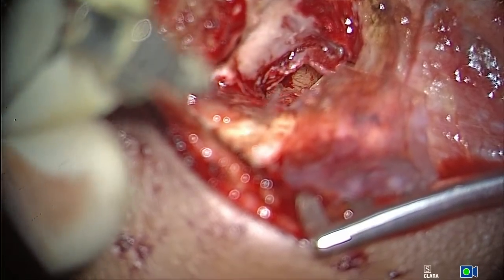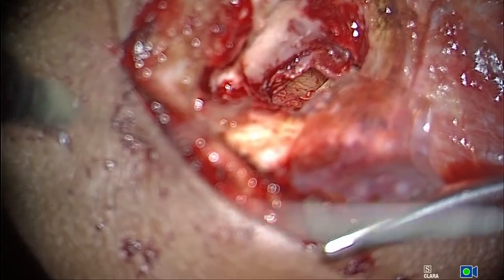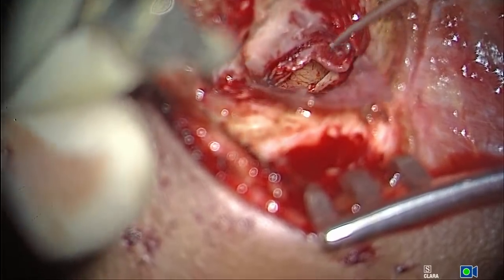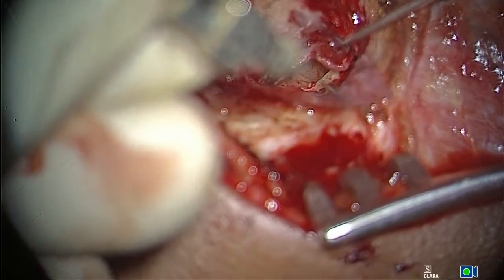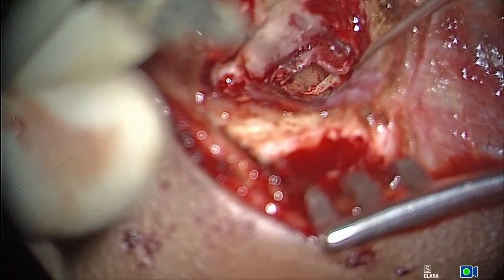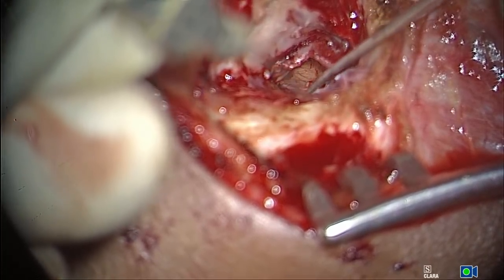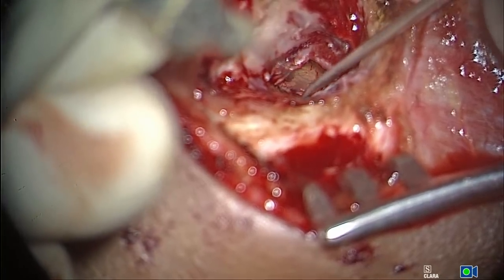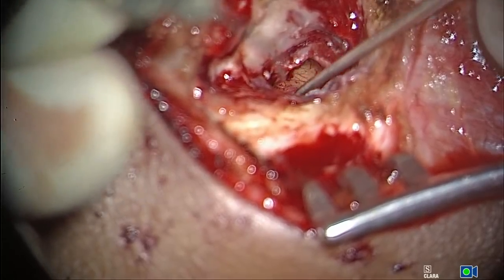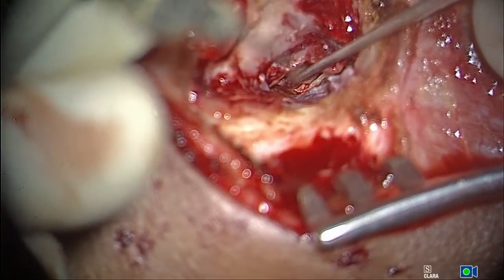you know, there's a lot of war with the perforations, and they're talking about ventilation pathways. So I really don't know what's the present concept, and maybe I am a little outdated regarding that. But this is the technique we have been following for a long period of time, and we have had success. I don't want to talk about my percentage of success, which will lead to ridicule. But you can see the technique.